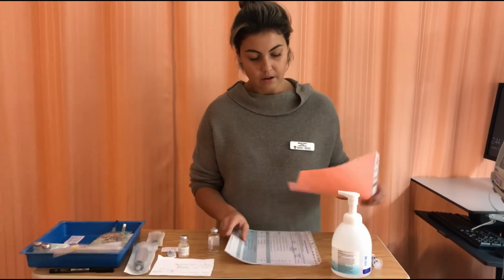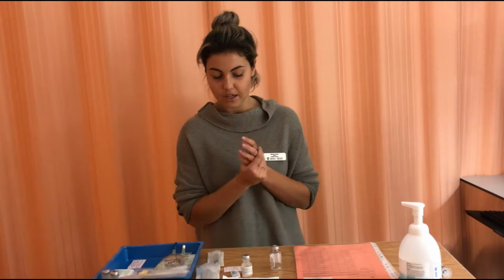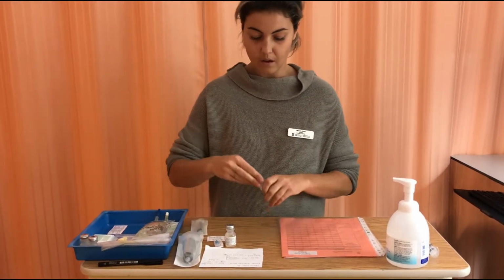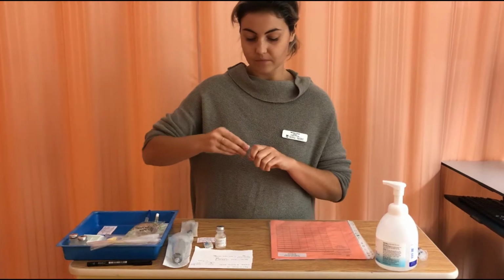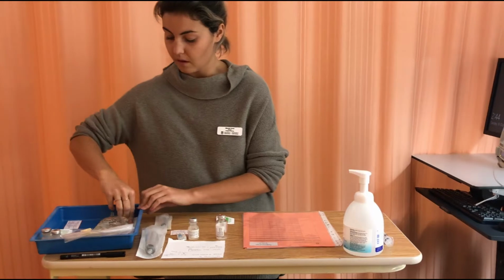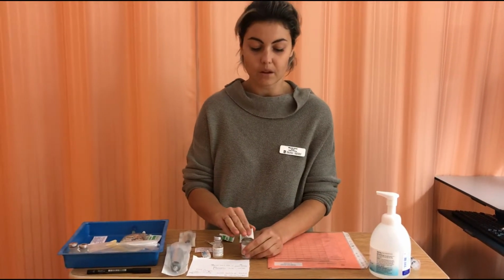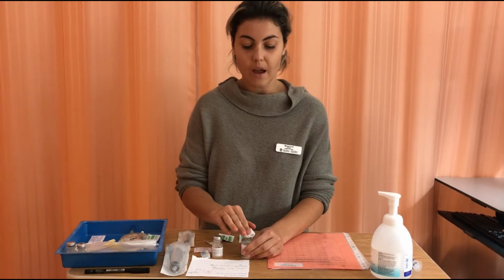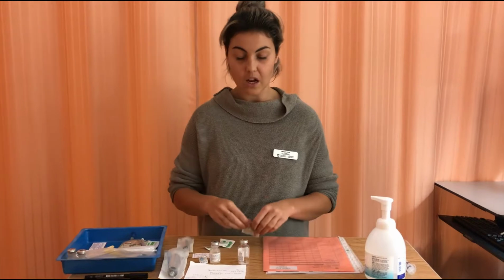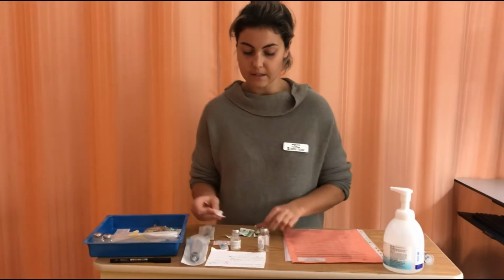All right. So, perform hand hygiene. Open my vial caps. I'm going to perform just using an alcohol swab, cleaning the top of the vials. I would clean it for 30 seconds and let it dry for 15, but for the sake of time for the video, I'm not going to be doing the full minutes.